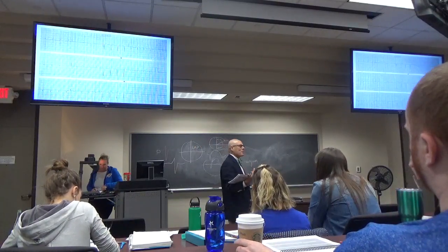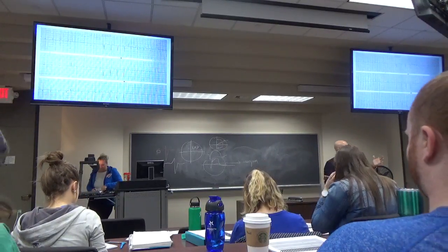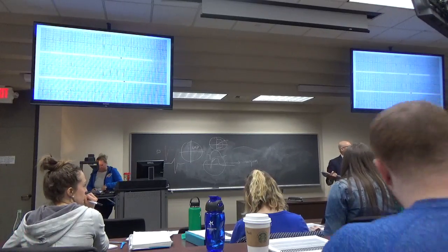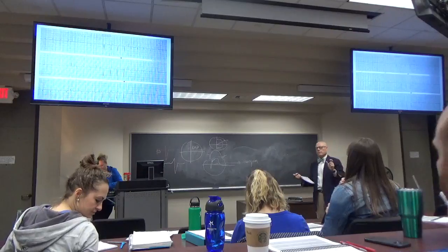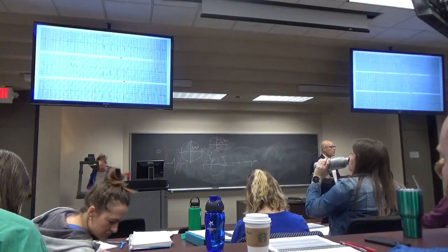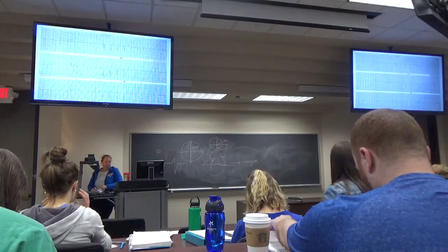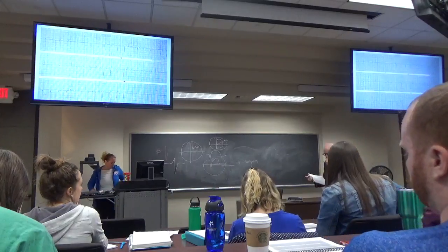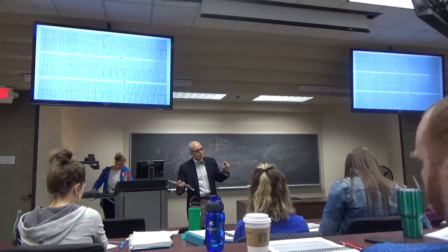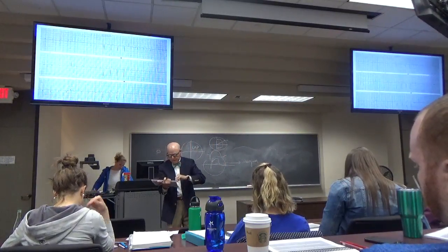I can find some places where it's a little greater than 0.20, first degree AV block. You know, clinically, what does it matter? Well, if the PR is too long, it's either a first degree block now, or it's probably going to become a first degree block in the near future. And most of the time, it doesn't matter. Most of the time, that's not a clinically significant problem. But it might be something you're watching on a longitudinal basis.